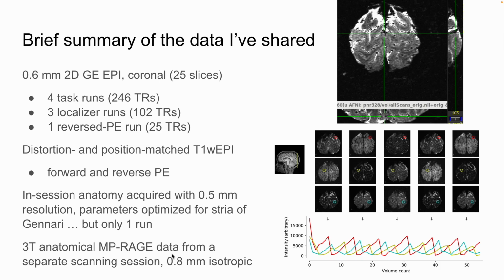And then to process that, I can go back into the headers of the DICOM and pull out the slice order information and the specific inversion times for each slice on each TR, and then do some math and estimate a T1 value for each voxel based on its particular intensity profile as it's cycled through these different inversion times over the course of my acquisition.